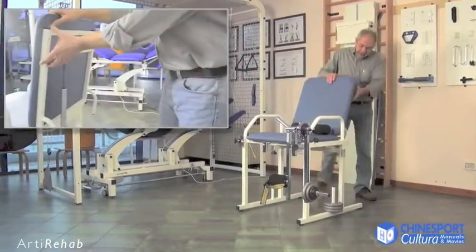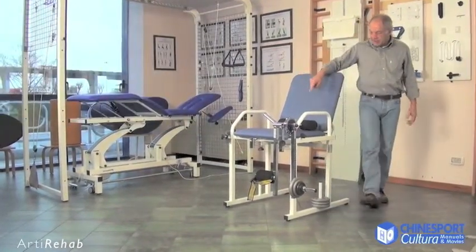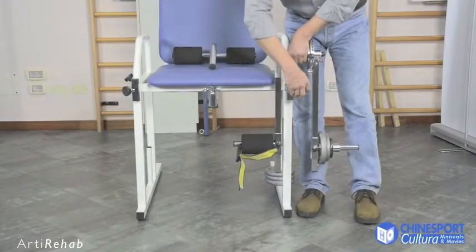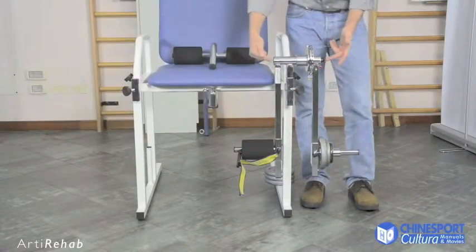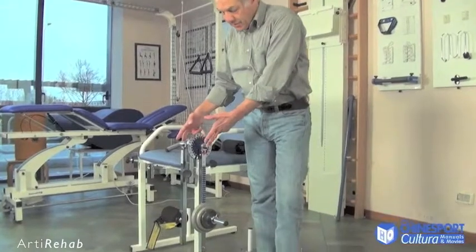It has a reclinable backrest which makes it possible to position the patient correctly. The moveable arm can also be adjusted in both height and depth so that the rotation axis for the moveable arm can be aligned with the axis of rotation for the knee.